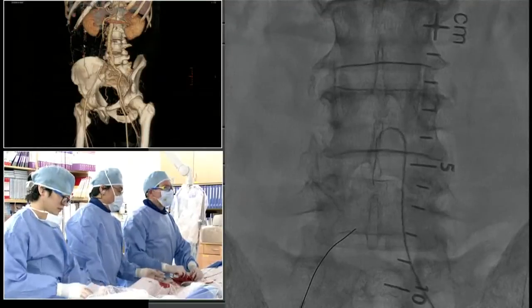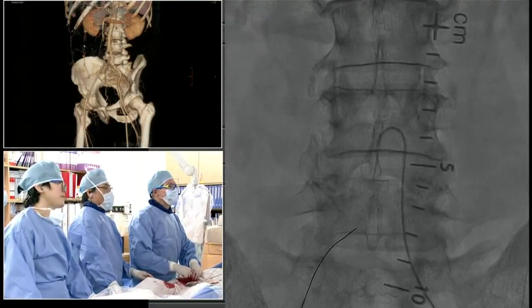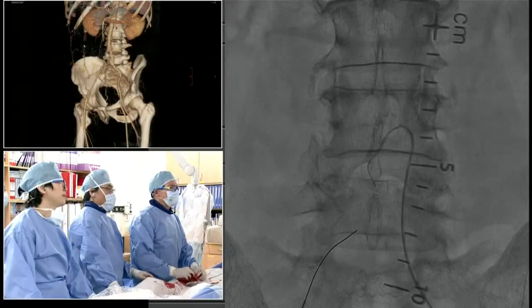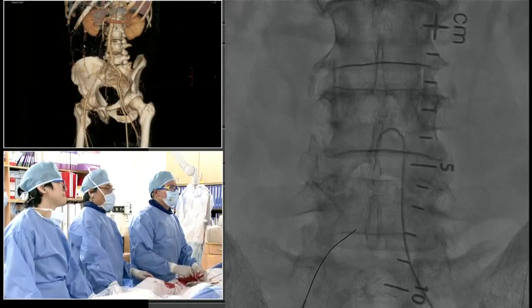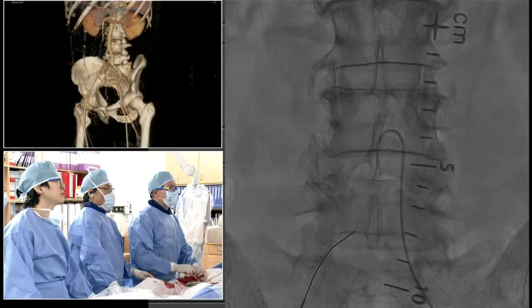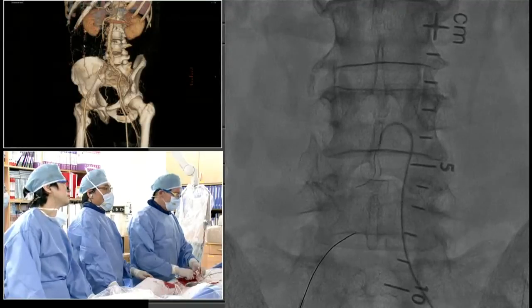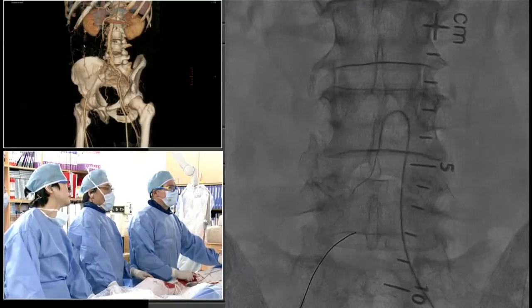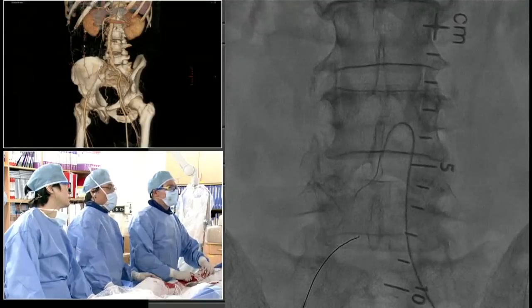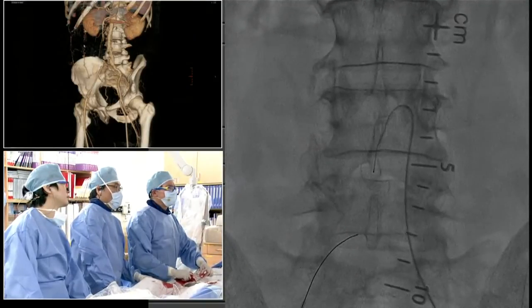You got a torquer there? It's sort of a double-edged sword. This stiff wire often will prolapse the catheter out. Yeah. But if I could get the wire where I had it before, I'd be happy with that. Success where the stump is so short that taking a V18 wire will allow you to get better purchase. Yeah, that's an idea. And then you can take an 018 quick cross to support you up and over. Exactly.